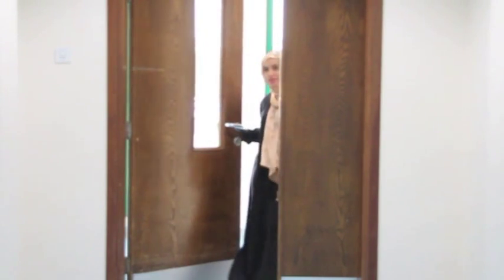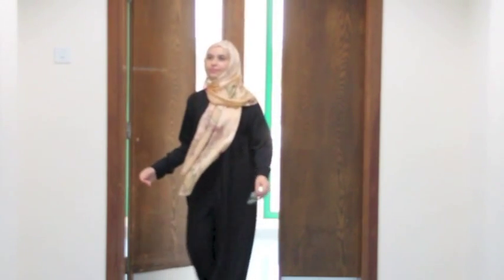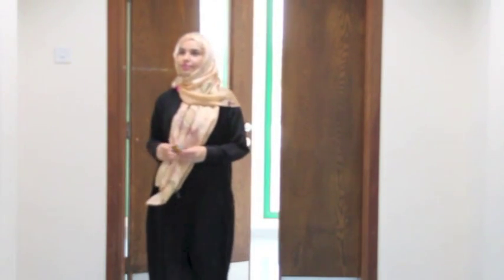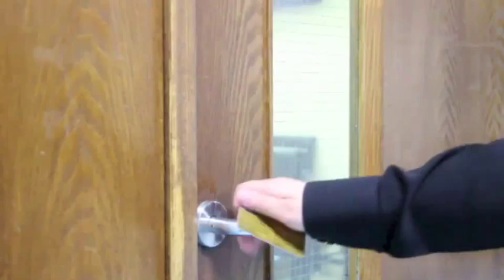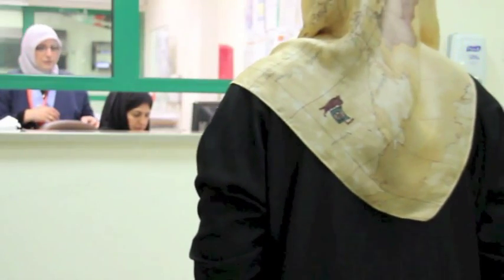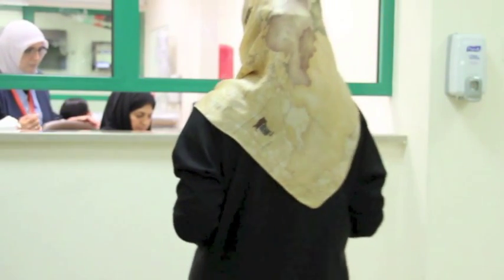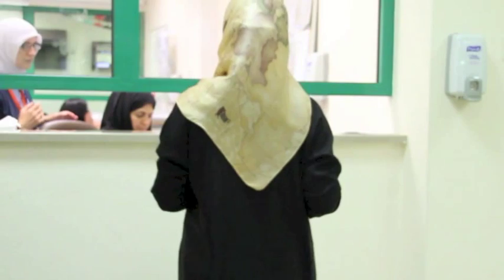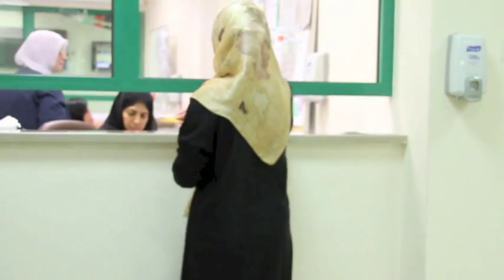As a patient, you will present at the phlebotomy area for registration. Be sure to bring your insurance card with you for the correct process for patient identification to be followed. The receptionist will check the hospital information system for the doctor's orders. These will be activated to generate the labels for the blood tubes.